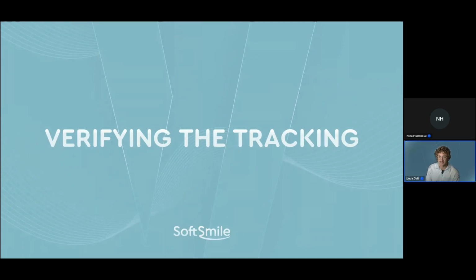So next, tracking loss is one of the most common issues we face during aligner treatment. And even with a well-designed plan, it can happen for many reasons, like biology, attachments, aligner performance, and, of course, patient compliance.